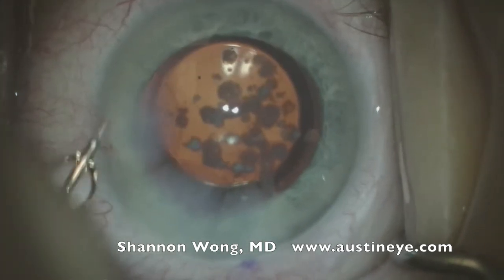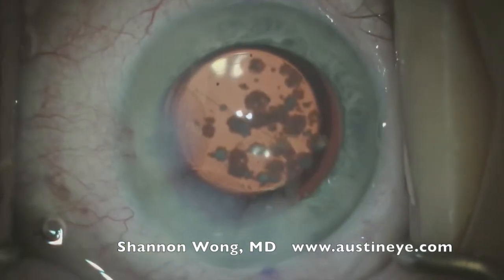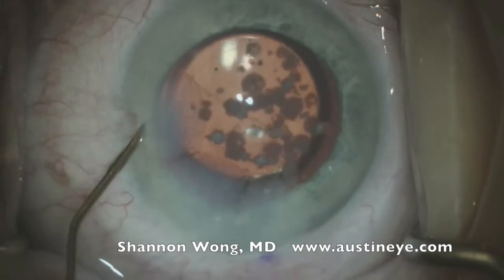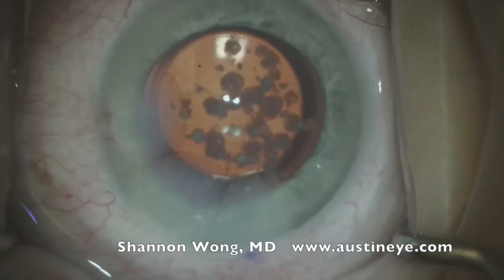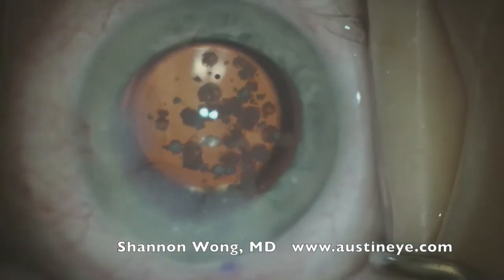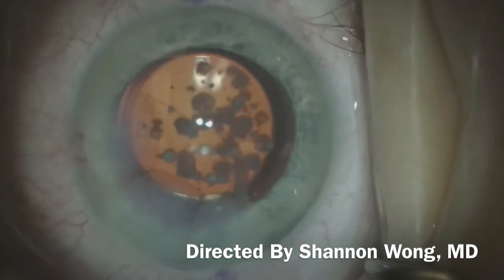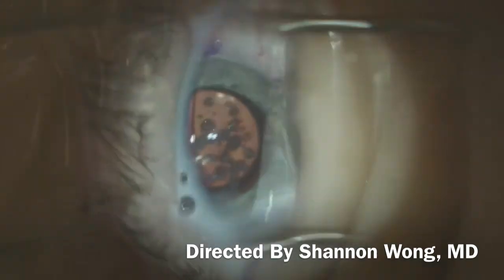The lens is now in perfect position and this patient saw great from both eyes the next day. She had a spherical result and was very pleased with her vision. This is an interesting case because it demonstrates laser cataract surgery in the presence of granular corneal dystrophy. Thank you for your time and attention.